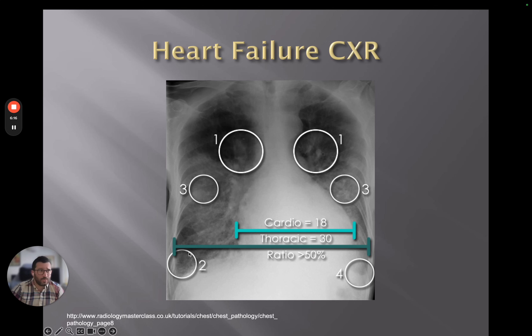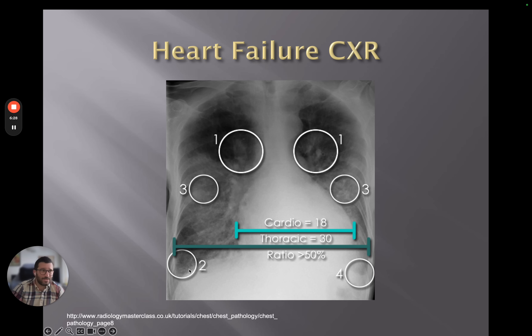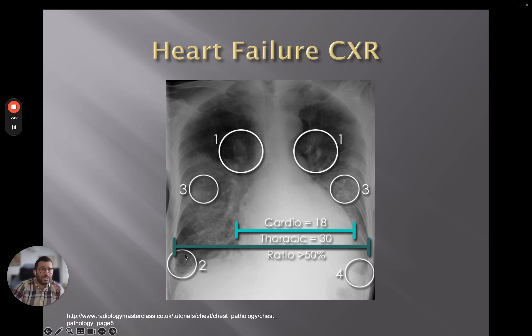At number two, we've got septal lines, also known as Kerley B lines — lots of things in radiology are named after the people who first described them. This is a sign of interstitial edema, which we'll also see on the next slide more prominently. Number three, we've got some airspace shadowing, predominantly in the perihilar regions in cardiac failure, sometimes described as a bat-wing distribution.